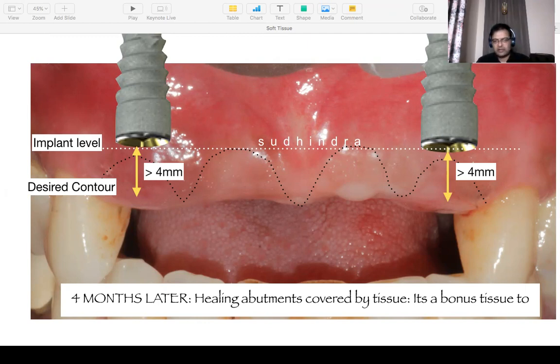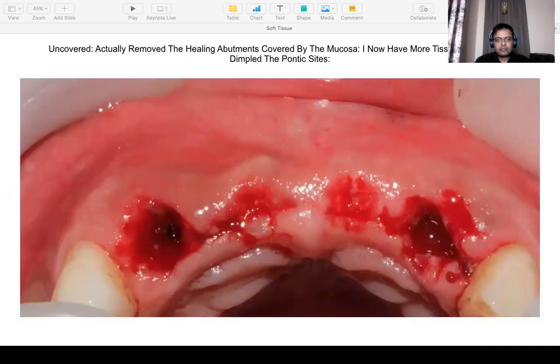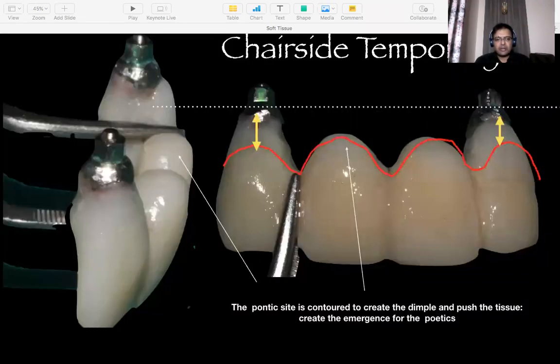There's no contact site, there's no scalloping, there's absolutely nothing, just one flat line. Okay, but what I want is a shape. So what we do now, because I had the healing abutments in place, we just did a small neck opening, took the healing abutments out, and then we custom made a temporary.